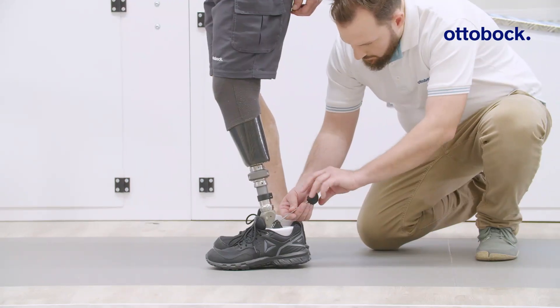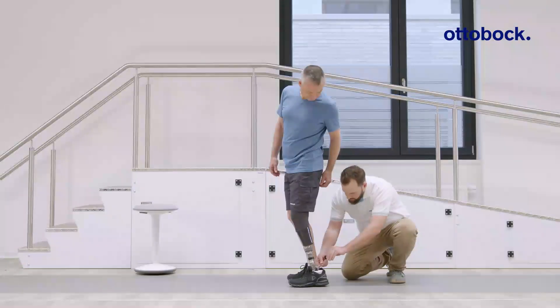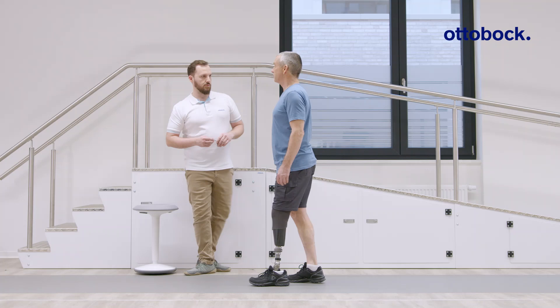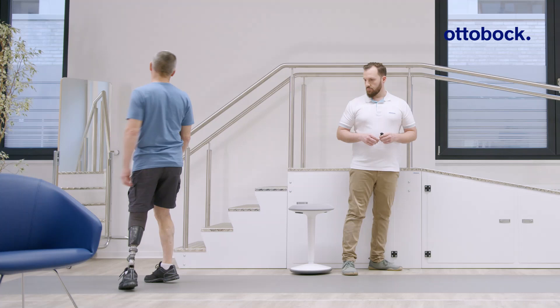First, optimize the plantar flexion resistance. Gradually adjust the value until a satisfying setting for the plantar flexion motion is found. Pay special attention to knee flexion support during loading response.